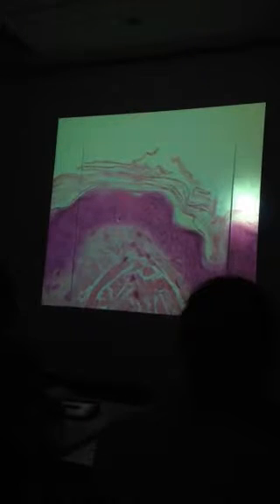Sitting down in the bottom of a gastric gland. It's got a nucleus right here, and then the clear areas here, they're really not showing up very well. I'll have a better parietal cell to show you. I just want to show you this one so you can get a feeling how much the other ones look. Okay, what's this? Name the, what tissue is this?